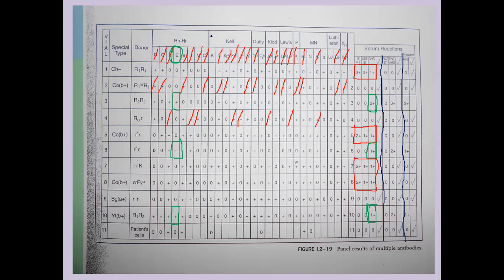So I'm going to put a little arrow to that one. Okay, I think we need to do more work to rule out big K. Not convincing to rule it in, meaning we know it's definitely there, or rule it out at this point. Because some of the reactions fit and some don't, and it's really hard to tell.